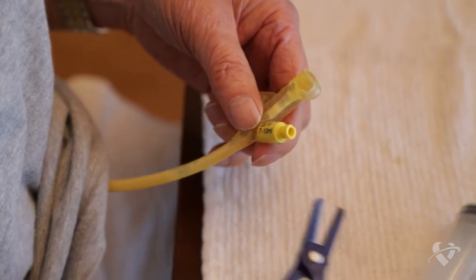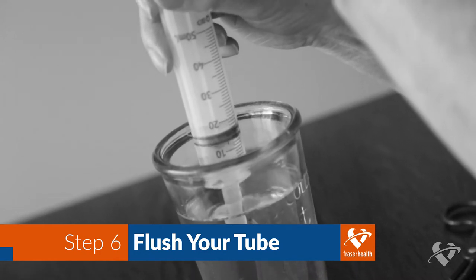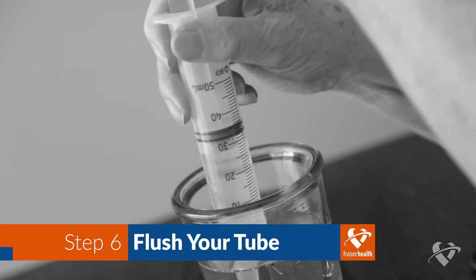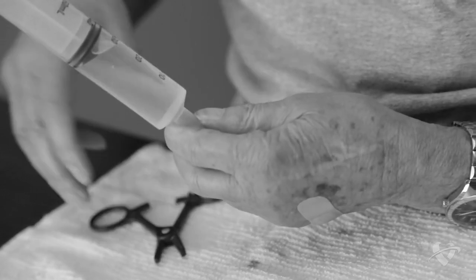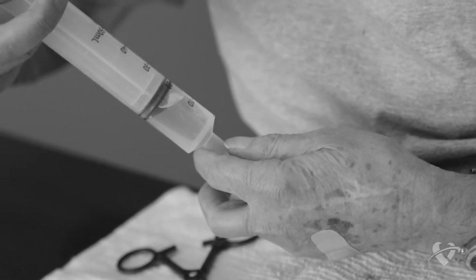The final step is to flush your g-tube once more to clear it of all the formula. This will help prevent a blockage. Follow the same steps as you did to flush your g-tube before you started feeding.